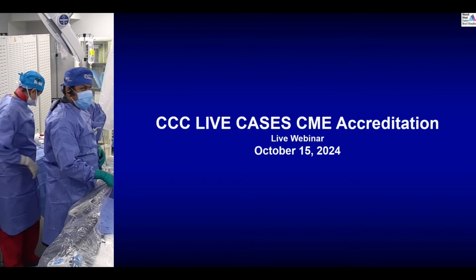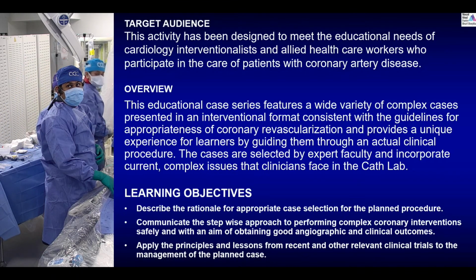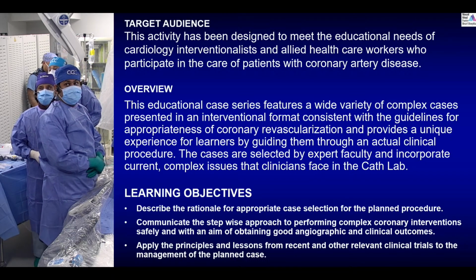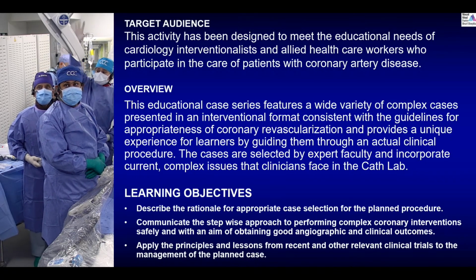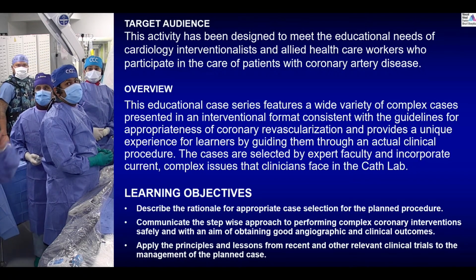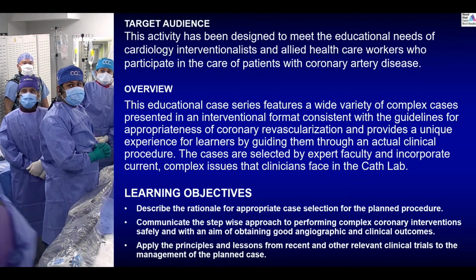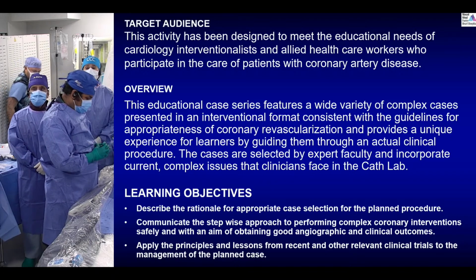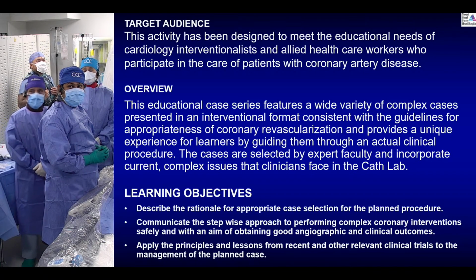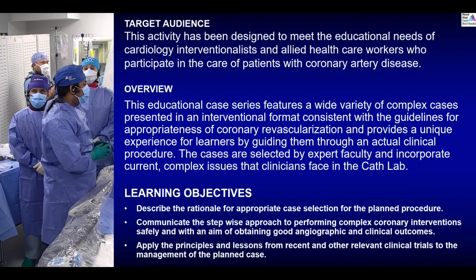So this is the CCC Live cases CME accreditation live webinar, and the target audience is those who will be attending the CCC Live, which could be anybody: interventionalists, cardiologists, healthcare providers. The overview is that it features a wide variety of complex cases presented in an interventional format, consistent with the guidelines for appropriateness of coronary revascularization, and provides a unique experience for the learner by guiding them through an actual clinical procedure. The cases are selected by expert faculty and incorporate current complex issues that clinicians face in the cath lab.